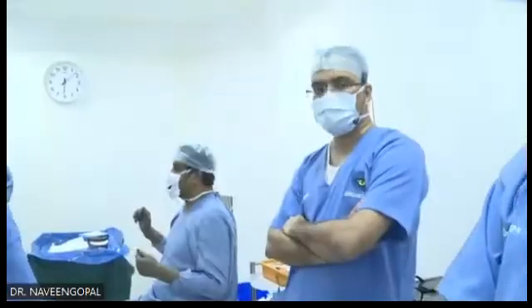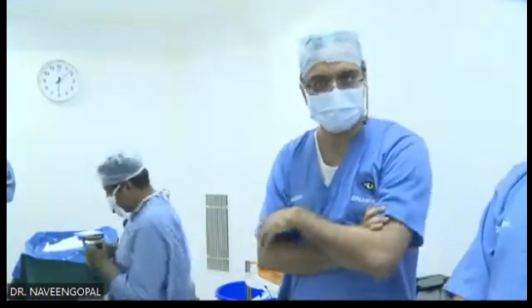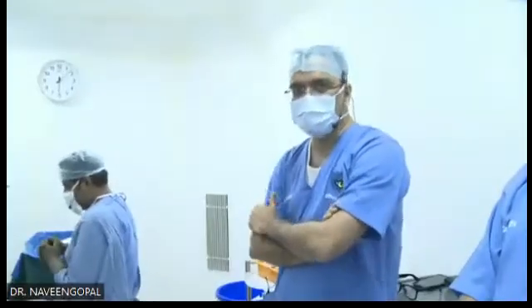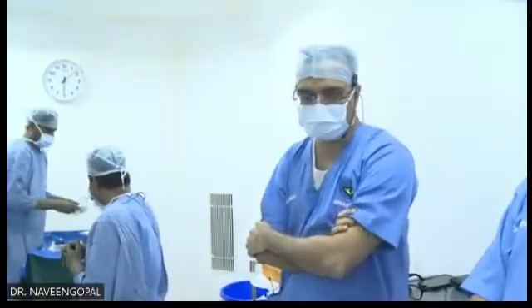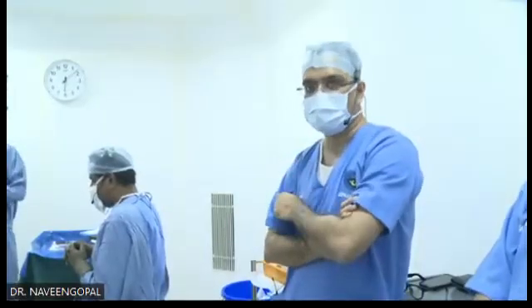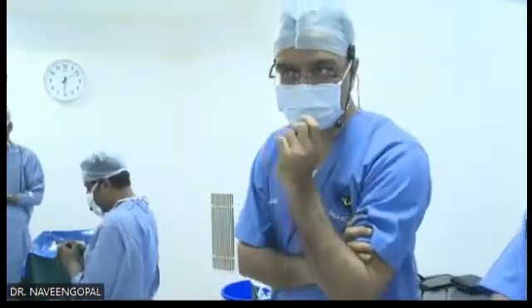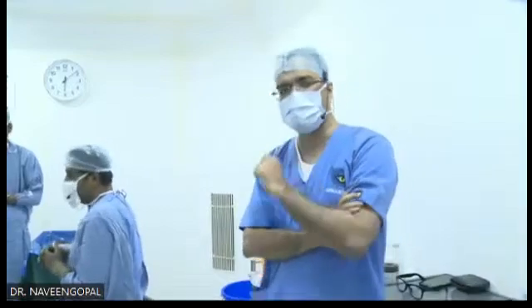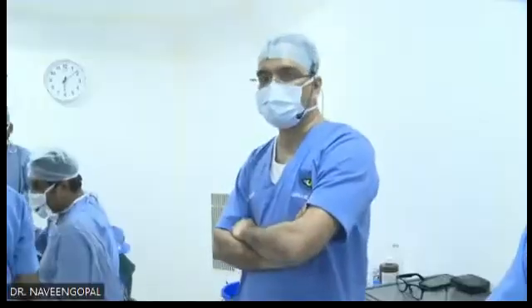We have put a lot of trifocal lenses, more than 150 in this OT. The results are very good with trifocal, that is Trios. This is an Indian version of multifocal. It is a little yellow colored, not like Panoptics color. It is very lightly tinted yellow. The results we get are very good here.